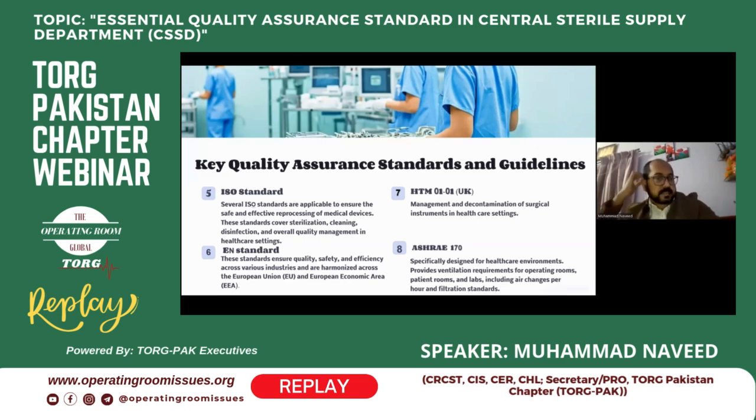EN standards ensure quality, safety, and efficiency across various industries and are harmonized across the European Union and the European Economic Area. EN means European Norm. They also give standards for quality assurance, safety, and efficiency for medical devices. The next is the UK standard on management and decontamination of surgical instrumentation in a healthcare setting. The eighth one is ASHRAE.